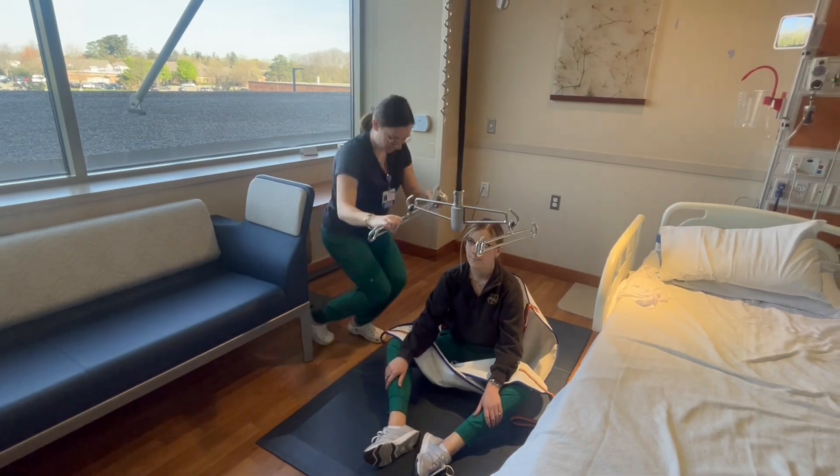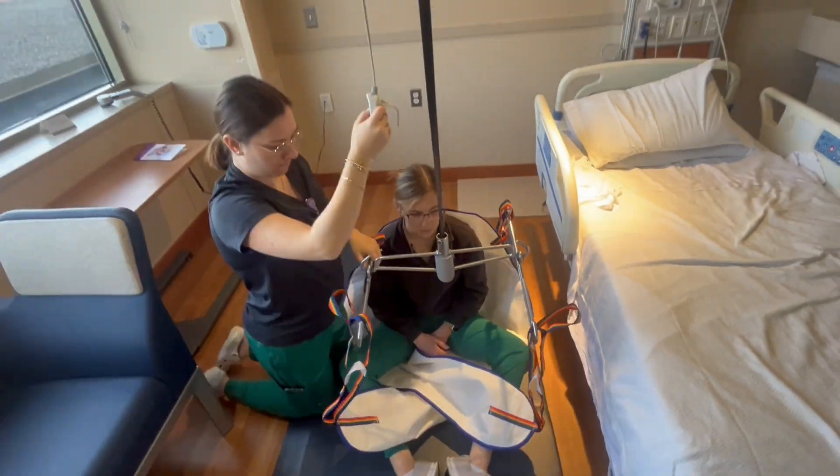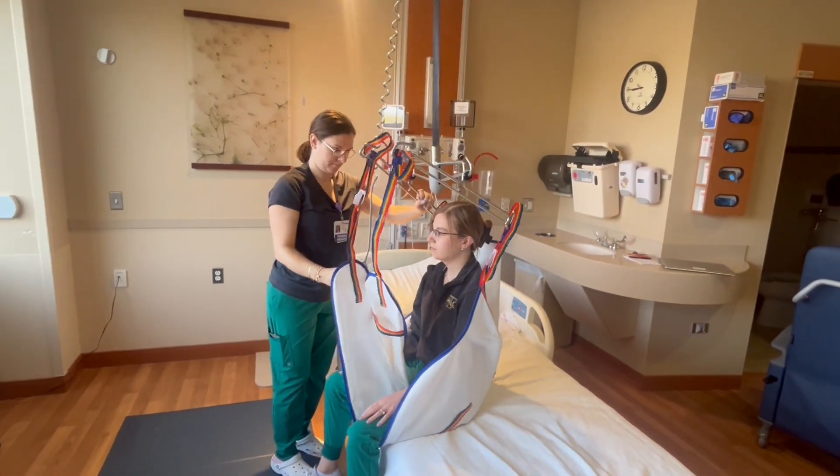An important note is that the C625 can lower all the way to the floor, meaning if a patient falls, you can use this lift to get them back up into the bed or chair. Either sling can be used, but if you can sit the patient up, applying the seated sling is a relatively quick and easy process. The use of powered lift devices can make transferring, repositioning, and mobilizing patients safe and easy. At Trinity Health Livonia, our goal is to maximize the mobility of all patients, and it's important to know the equipment available to help achieve our mobility goals. These powered lift devices — the Sit-to-Stand, the MaxiMove, and this C625 ceiling lift system — are there to improve patient outcomes and keep caregivers safe in the process.